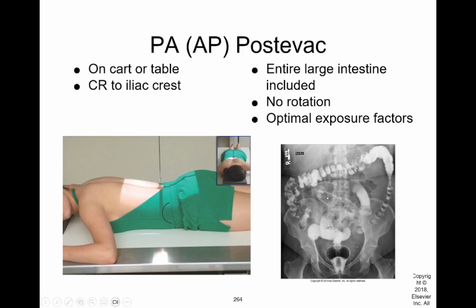And again, your positioning there would be to position one like the pelvis, so the top of your image receptor would be at the iliac crest for that image, and then for the second image, the bottom of your image receptor would be just below the iliac crest, so you make sure you have some overlap. Because of the divergence of the central ray, if you position both of them at the iliac crest, you're going to miss some anatomy. So you want a little bit of overlap.